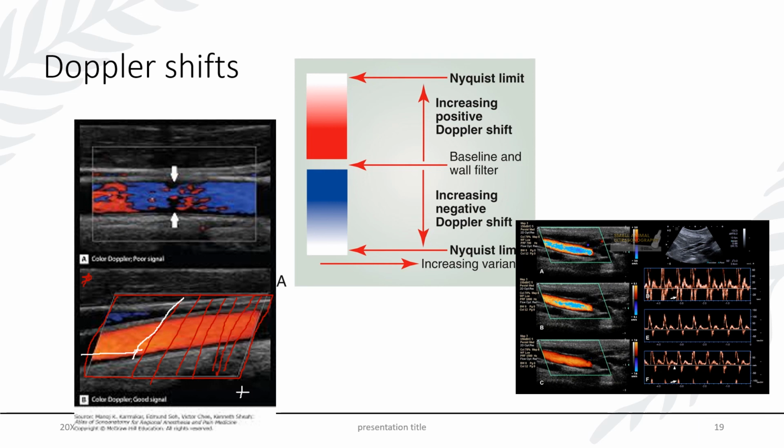If I have my scan lines going perpendicular, as I do in this box, the motion of my blood flow is going to bump into them, but it's neither really going toward or away. Because we don't have it going toward or away, those clashes aren't as significant, and we don't get the same kind of Doppler shifts that we otherwise would get with a steered box. Therefore, you see this lack of color filling in here.